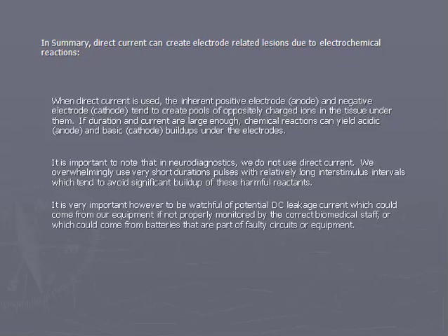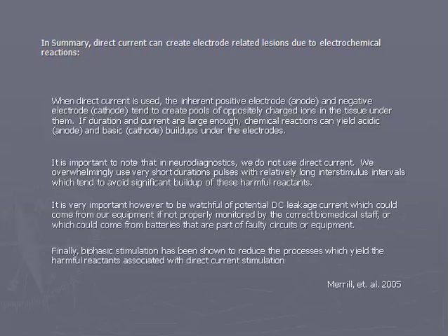faulty circuits or equipment. Finally, biphasic stimulation has been shown to reduce the processes which yield the harmful reactants associated with direct current stimulation. Slide 30. Let's discuss pressure point lesions. What is the problem? First, external pressure can damage tissue.